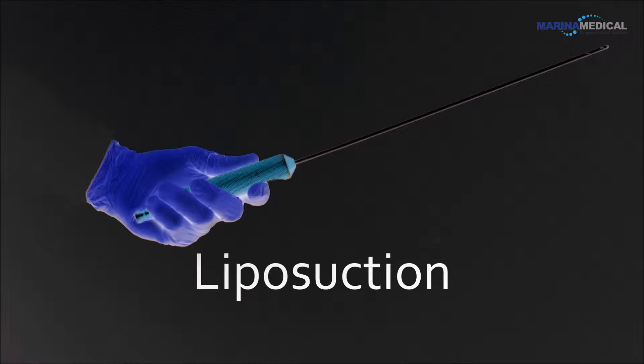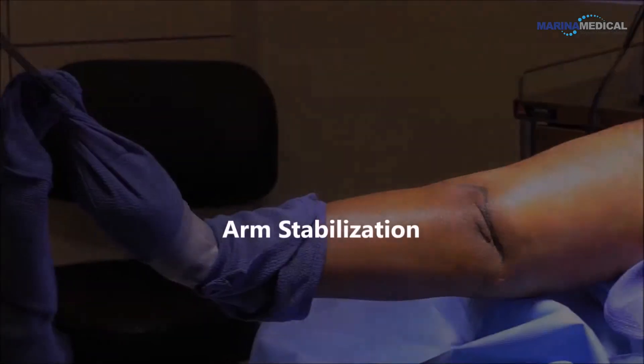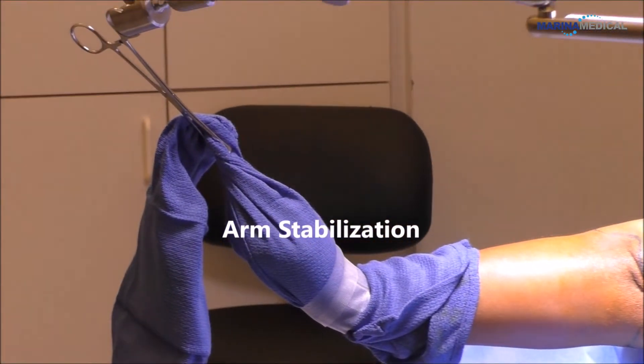Well, the hardest thing for my assistants to do is to hold the arms and the legs, which I like to move around a lot. I don't work with my patients asleep — I work with them awake most of the time. So for me, it's become the extra hand that holds the limb or makes it easier to hold, so that my assistant doesn't have to struggle with the weight, because my assistants are all small women.